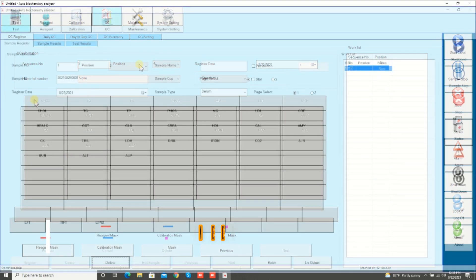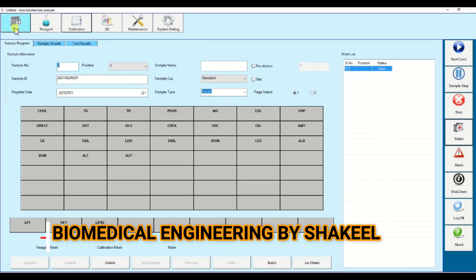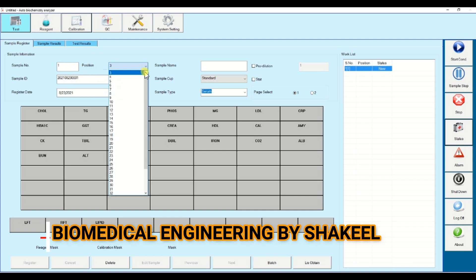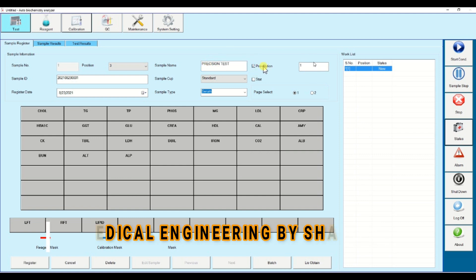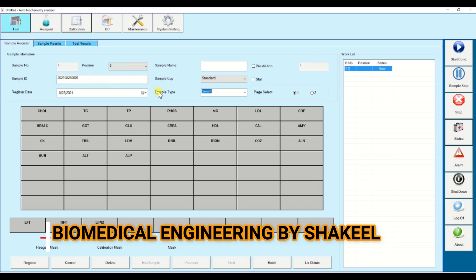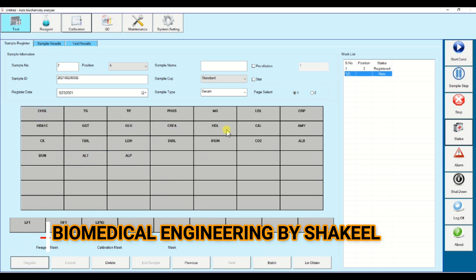Now it's time to run the patient sample. Click on test, enter the sample number if you have one or keep it as is, and select the position. I already assigned positions one and two for the calibrator, so available positions run from three up to 39. Enter the sample name — I'm writing 'precision test' to check machine precision. You can write any patient name. There is also pre-dilution: you can select 1:25 or other ratios. Enter the sample type — serum or urine — and you can select a test or a profile such as LFT, RFT, or lipid, then click register.